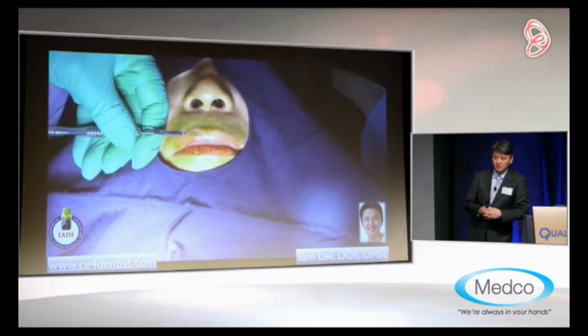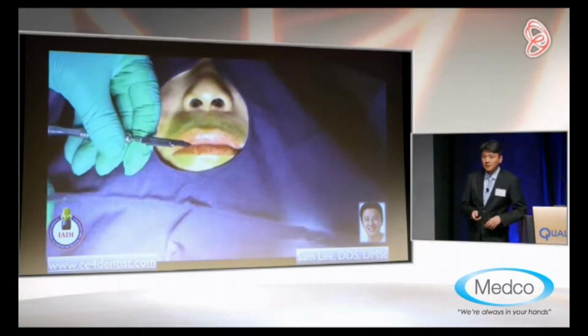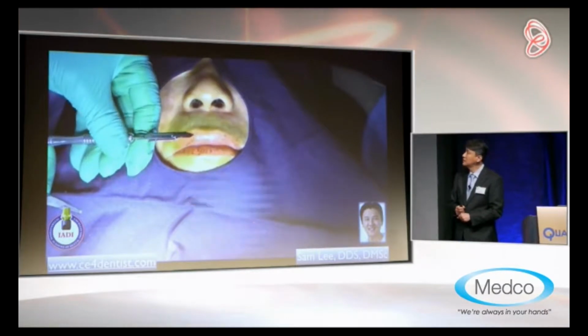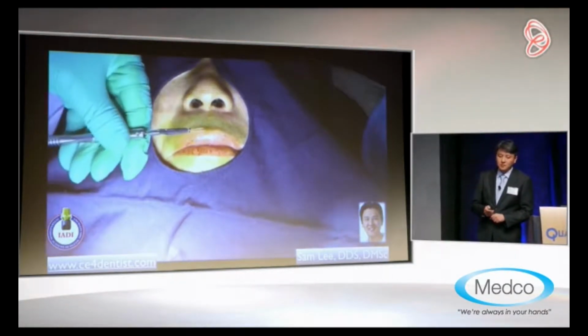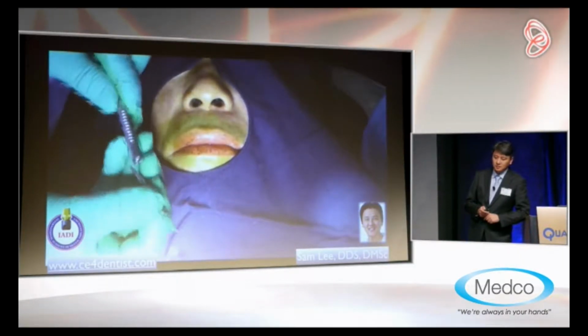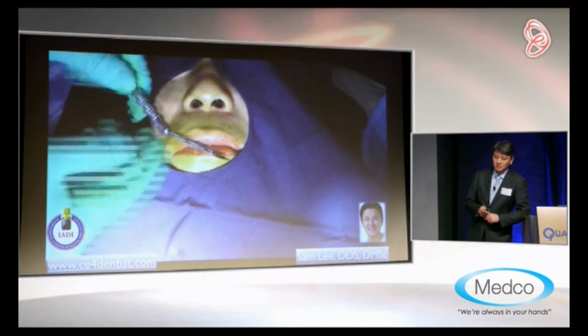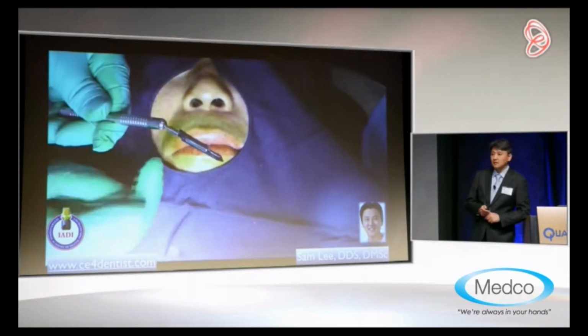And the key about the double blade is that one height should be lower than the other, because the height of the palate is not parallel. Okay, so this is a double blade, and inside the mouth it is very important to be able to change the angulation as well, so that you can adapt your angulation.